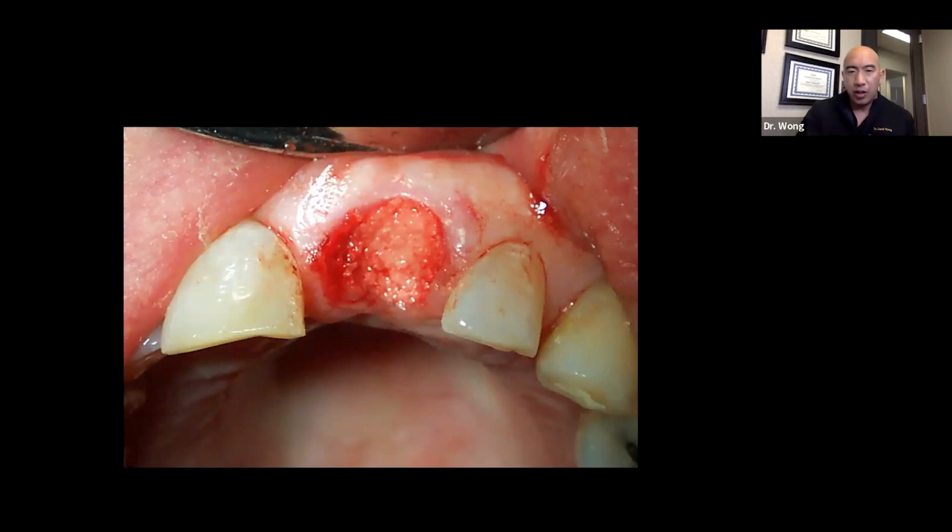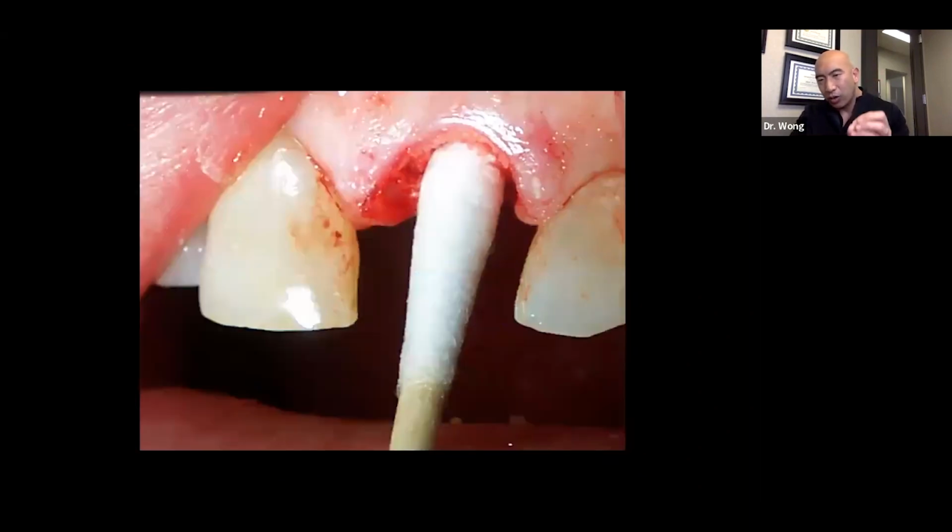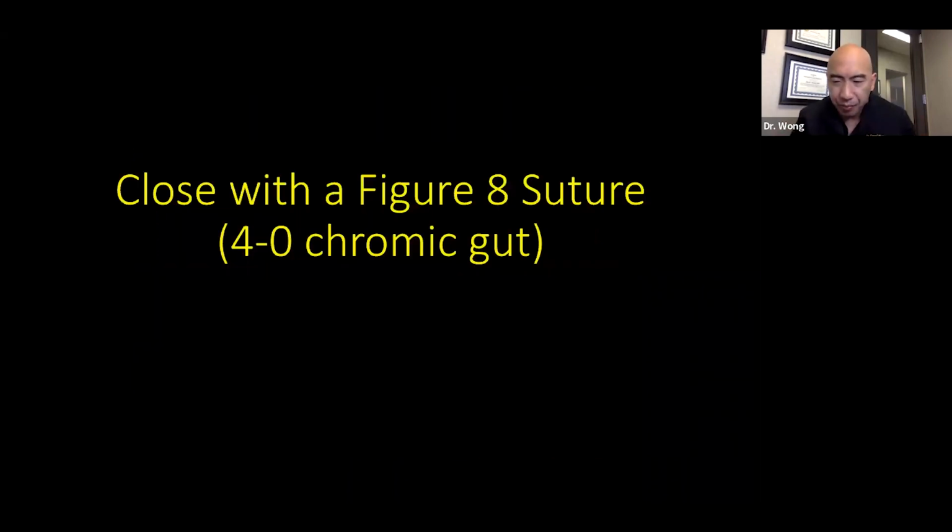And then all you're going to do is put your bone graft material into the socket and condense it with your cotton tip applicator. I use a dry one whenever we have a bleeding socket or a patient with a lot of saliva, because you're trying to condense this powder while blood and saliva is trying to get it to come out. So this cotton tip applicator is a really cheap and easy way of absorbing that moisture while you're condensing the graft.